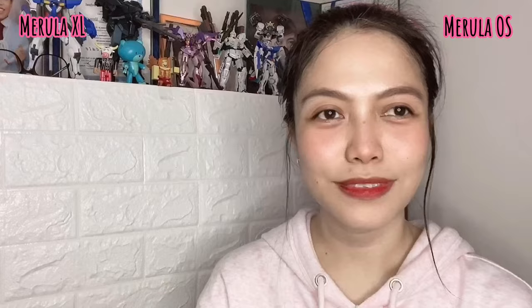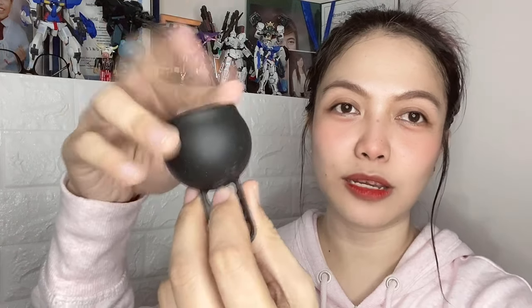Let me share my experience with the Marula OS and things you might want to consider before getting this cup. One thing I like about it is its high capacity. Since I'm a heavy bleeder, I need high capacity cups so I don't have to dump frequently. This cup served me for 8 straight hours, half full. I couldn't maximize the full capacity because my cervix sits inside the cup. Another thing I like is the long ladder stem — when my cervix is at its highest at 60 to 65 millimeters, I can still easily toggle and wiggle the cup down using the stem.